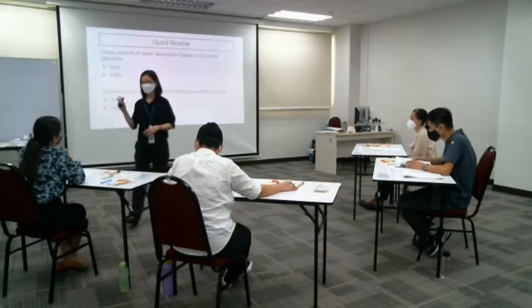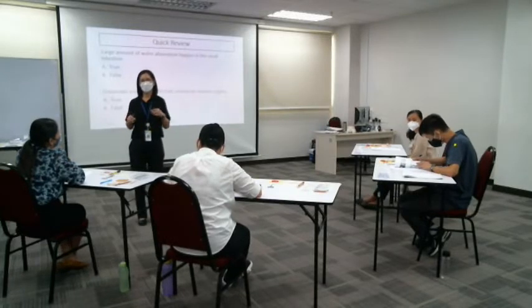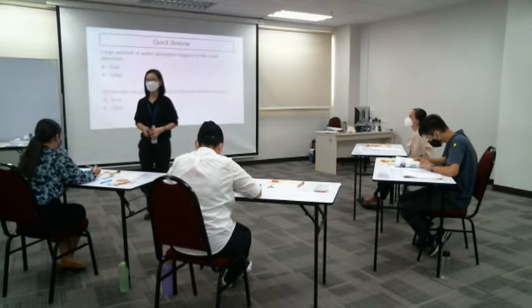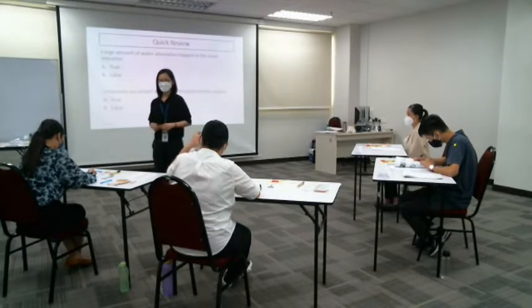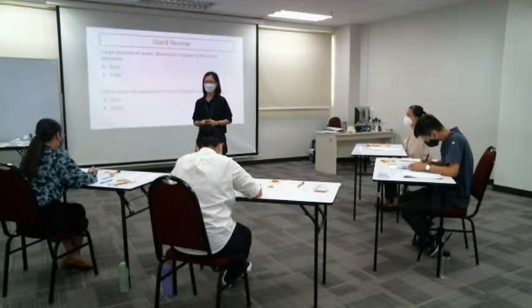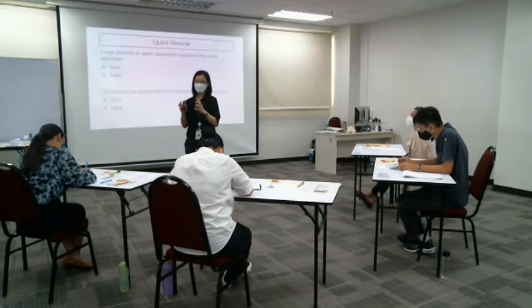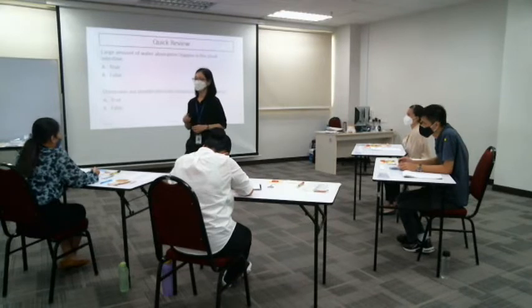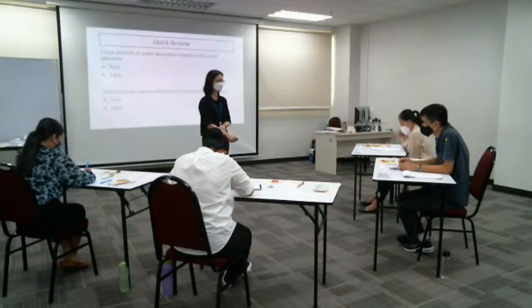Urostomy has more types than the one that I showed. But what I focus on in today's training is the ileal conduit, which is also the most common case that you can see. It usually happens to a patient with CA bladder. If the bladder is intact, there is a possibility of urine coming out from the bladder as well, by putting in a tube and other surgical procedures.